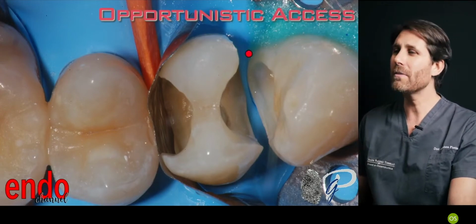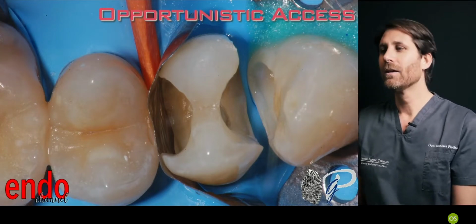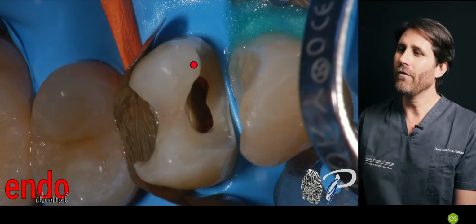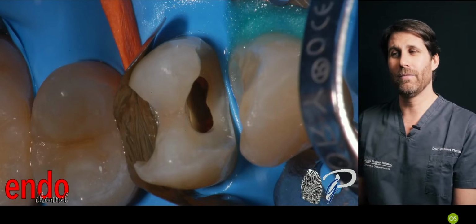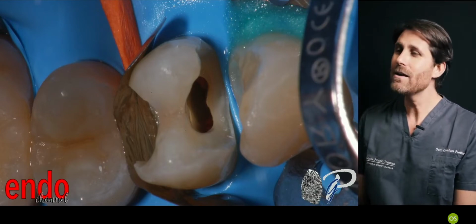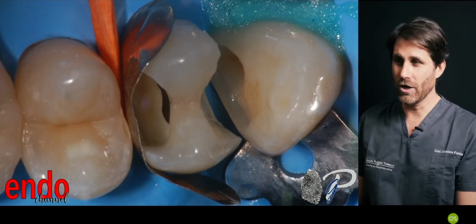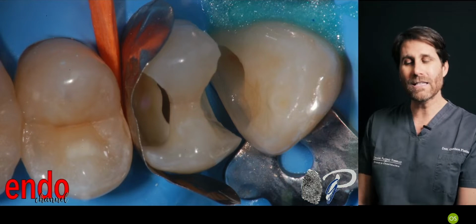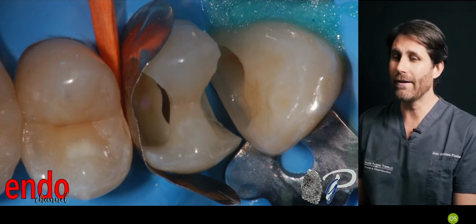I performed two separate cavities, one mesial and one distal, so that from the mesial aspect we can have a look at the root canals and perform the root canal treatment, and then this patient could only afford direct restoration. So in a patient like this, I decided to maintain as much tooth structure as possible because I needed to perform the two direct restorations.